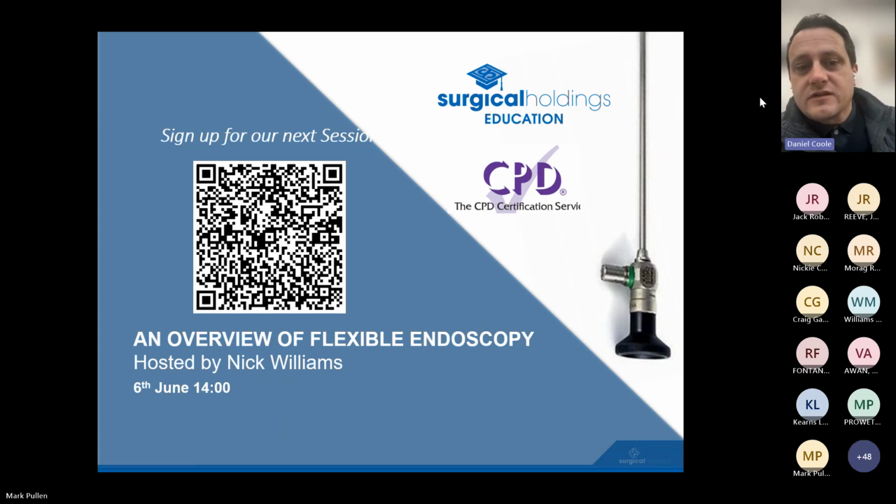The colour cabling on the light leads that you've mentioned is useful, but I'm trying to think how else you could safeguard against damage if it's untrained people, as well as the staff that are in the department every day. How can we prevent damage just through poor handling? I'm struggling on this unless there is a degree of education that they probably shouldn't be touching those scopes.